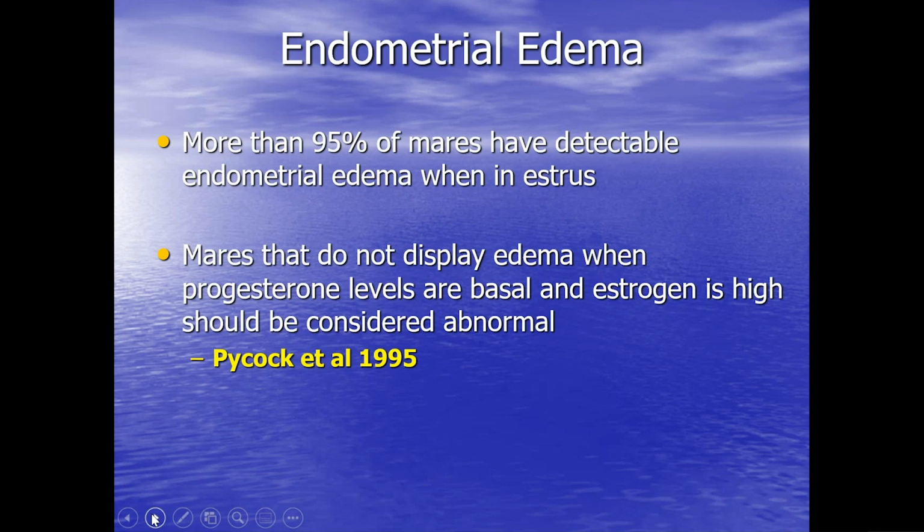So it could be there's a remnant of luteal tissue there. So I would urge you to do the little injection of a very tiny dose of prostaglandin. But if you still don't get any edema, I would usually keep monitoring her. She may go on to ovulate, still no edema. If that is the case, I make in big bold notes in her record, this mare may ovulate with no edema developing. Then at least the subsequent cycle, we think, well, this is this mare, so we better go ahead and inseminate her.